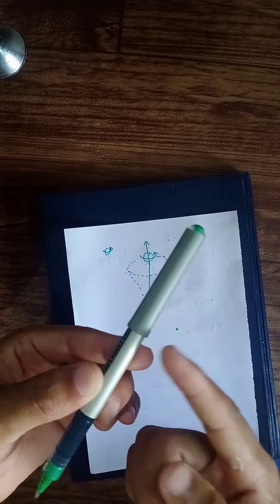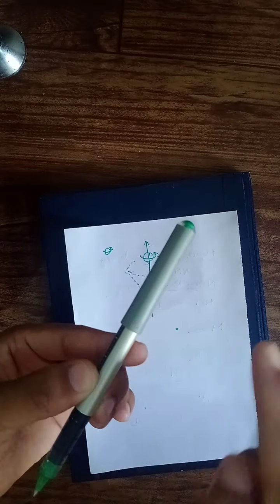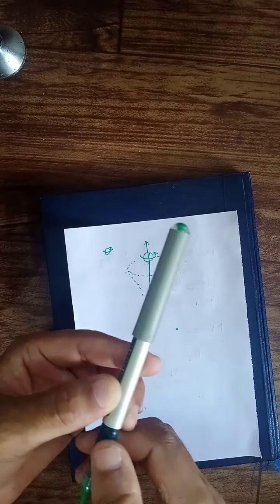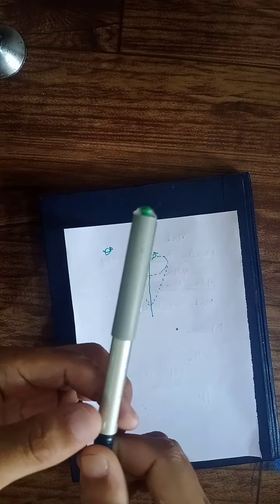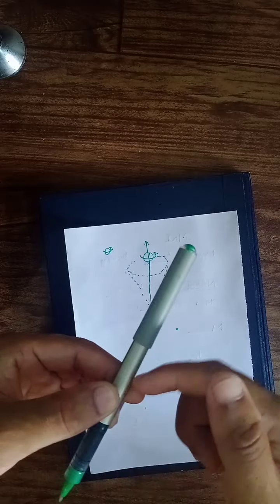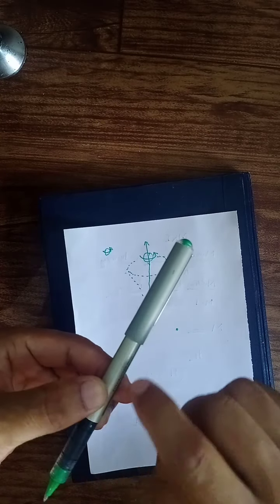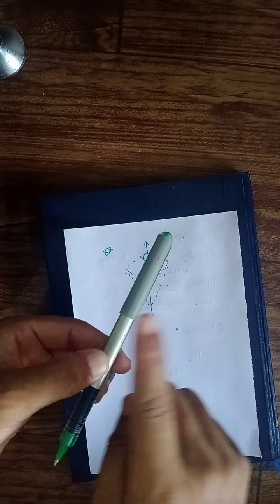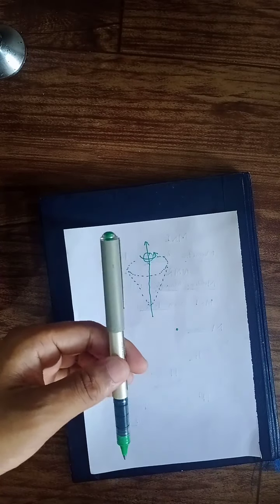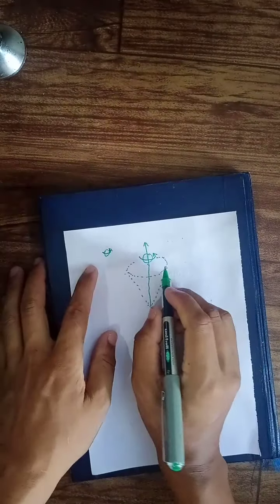It flows through the conductor, but there will always be a magnetic field around the conductor through which charge is flowing. That means if the charge flows, there will always be a magnetic field around its area, right? So the same with the body.